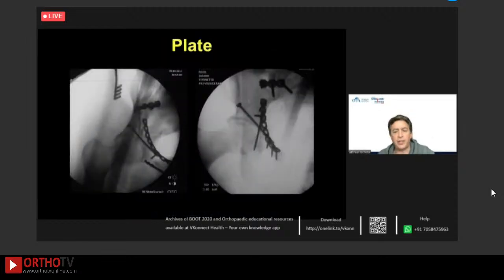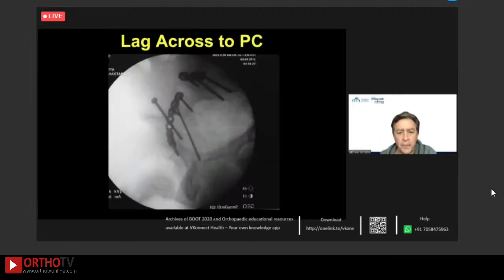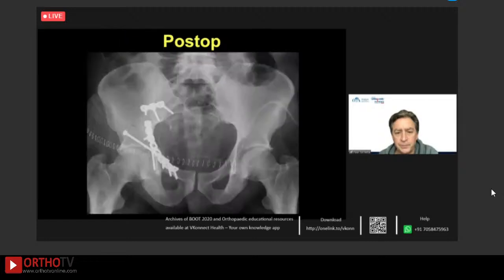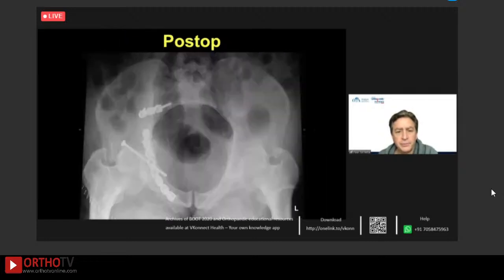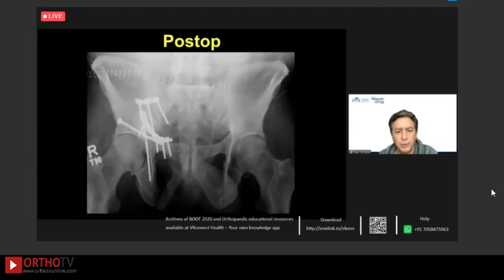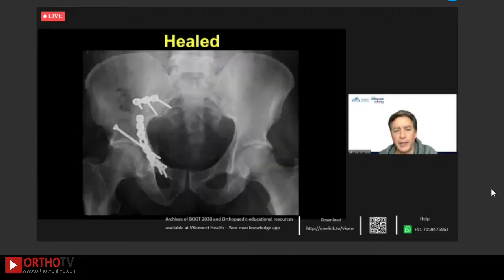And then I did the same thing you did. I put that little plate on. I lagged into the posterior column as well, as you can see here. And this was sort of the final post-ops. And he went on to do pretty well. But I think it's an interesting pattern when you have these combination injuries.